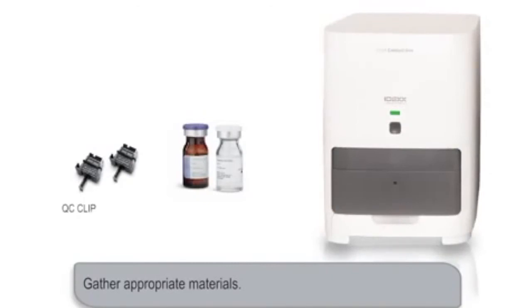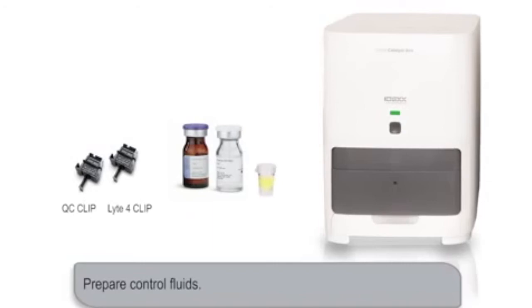Materials include the QC clip, Lyte 4 clip, and VetTrol control, and you'll need to prepare the VetTrol control for processing using the detailed instructions found in the product packaging.